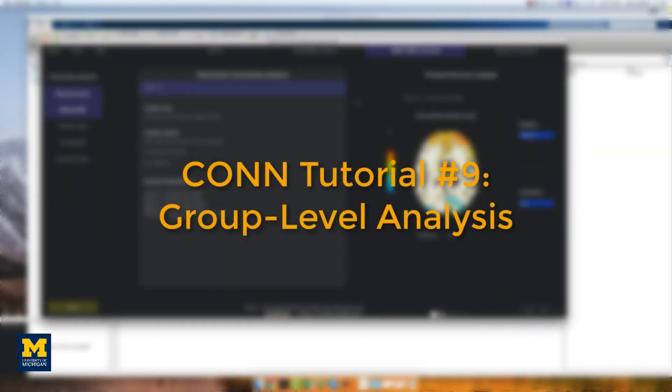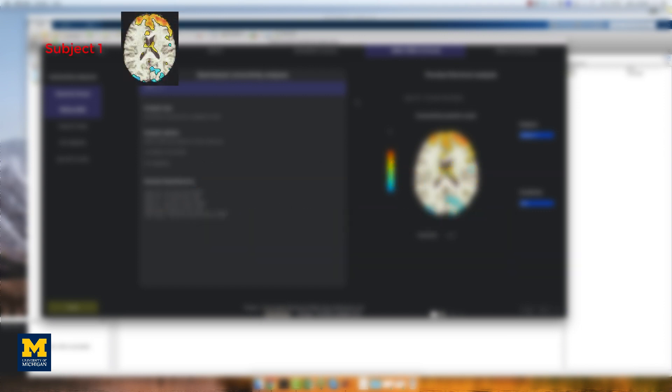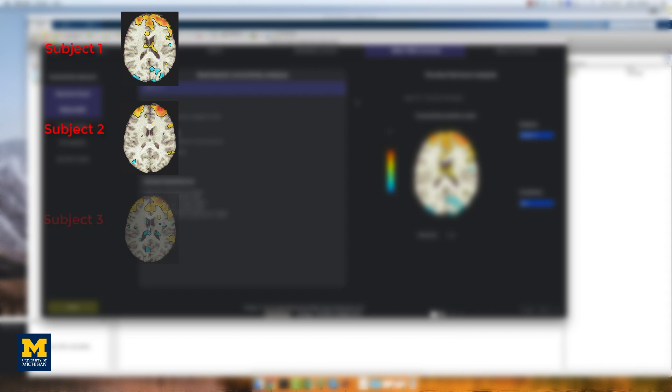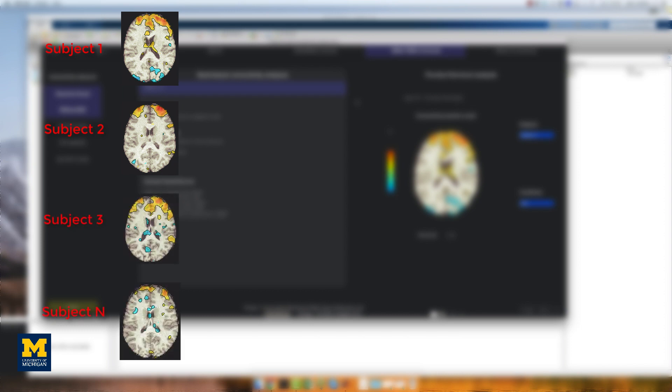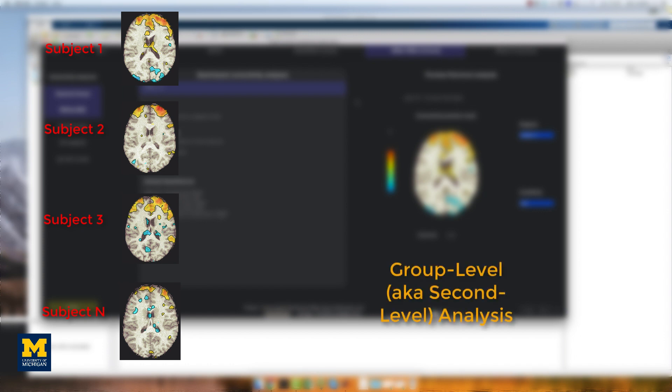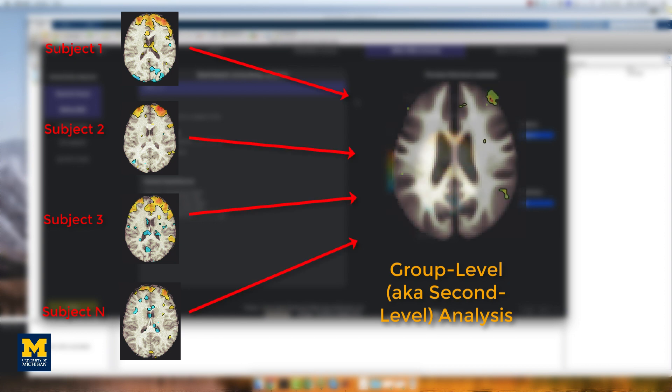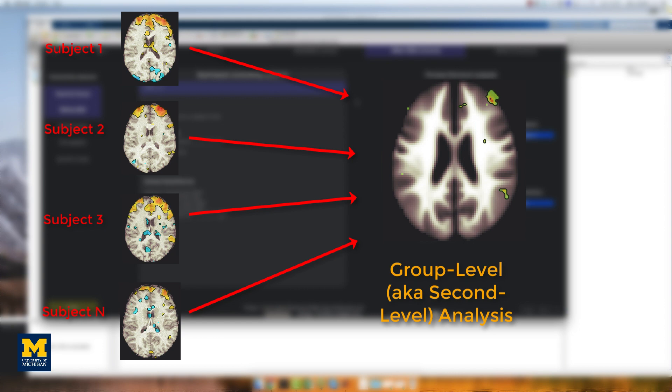Our goal in analyzing this dataset is to generalize the results to the population that the sample was drawn from. In other words, if we see changes in functional connectivity in our sample, can we say that these changes would likely be seen in the population as well? To test this, we will run a group level or second-level analysis. We calculate the mean and standard error for a correlation estimate and then test whether the mean is statistically significant. In the last video, we analyzed a single run for a single subject. In other words, we ran a first-level analysis. This is great for seeing whether there are significant correlations within a single subject, but we cannot do any group inference.